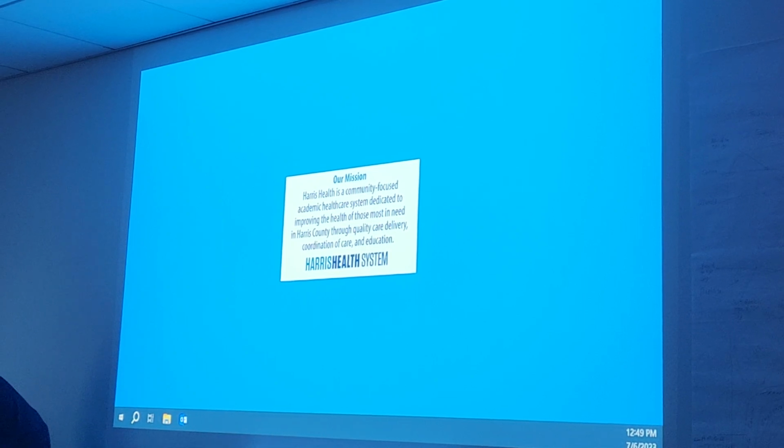Miss Bonilla, what do you mean by not labeling? What will you include and not include? You'll have to label the anatomy.